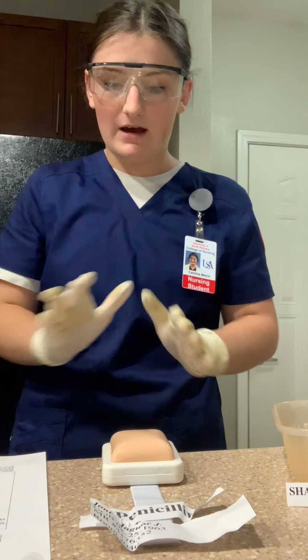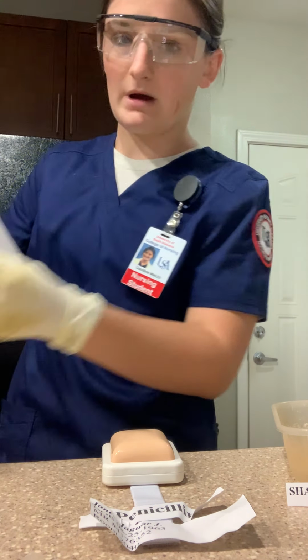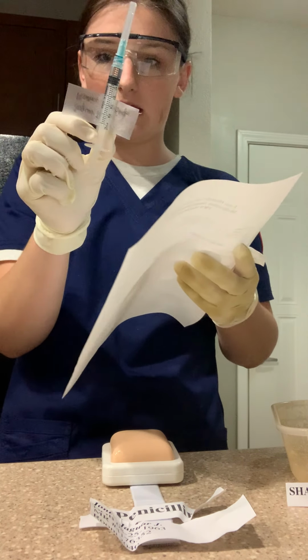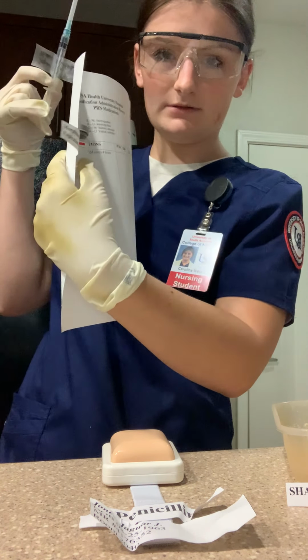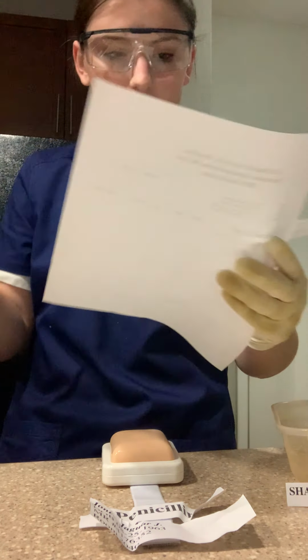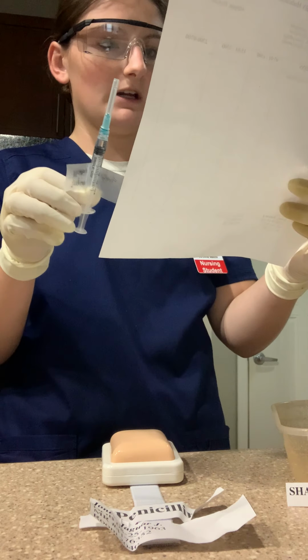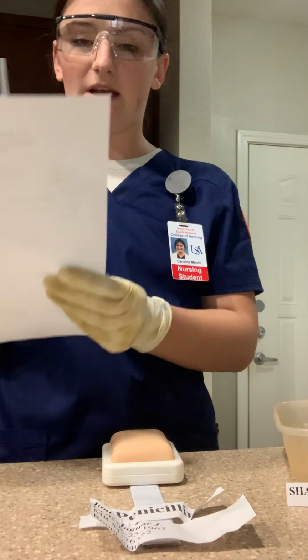I'm now going to, again, verify my drug using the vial, my MAR, and my syringe. So I have morphine sulfate in my syringe, on my vial right here, and on my MAR. It has not been given in the last 4 hours, so it is time. There's 5 milligrams. This is an intramuscular needle, and it is an intramuscular injection, and it is needed for pain.